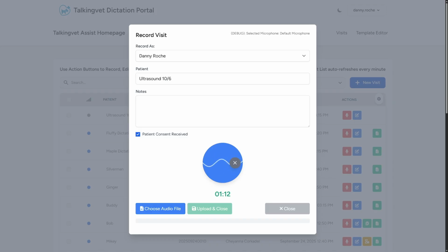Stomach looks normal, wall layering intact, no foreign material or obstruction seen. Intestinal loops have good layering details, and the colon has normal fecal content. Then we have the pancreas, small but normal in echo texture. I'm seeing one jejunal lymph node that's just a little prominent, around 7 millimeters in short axis, but nothing that looks suspicious. No free fluid in the abdomen, and the uterus and ovaries look completely normal. Overall, I'd call this a normal scan, except for mild hepatomegaly and that slightly enlarged jejunal lymph node, which is probably reactive. Everything else looks great.